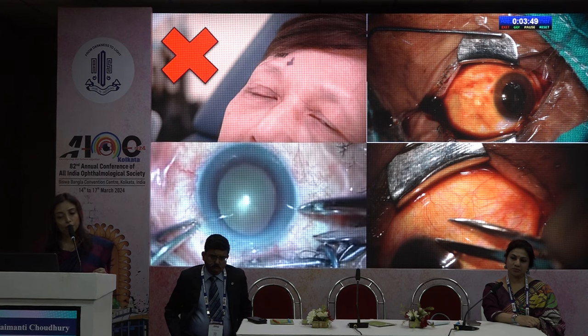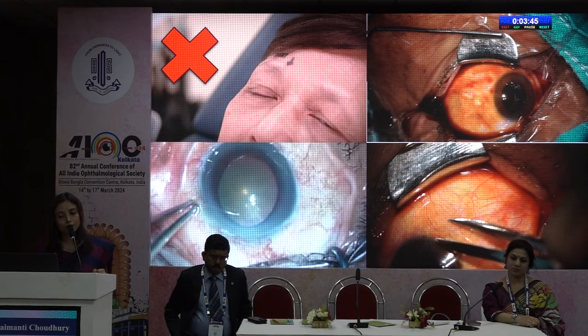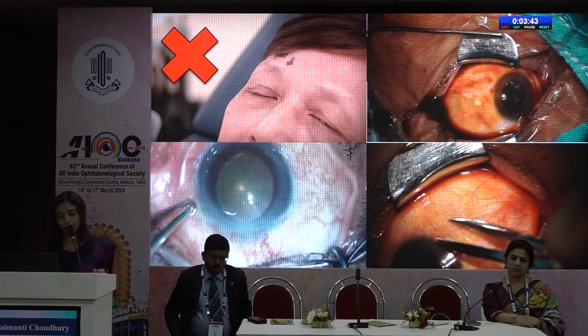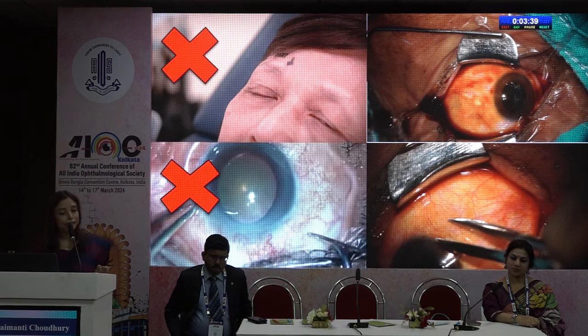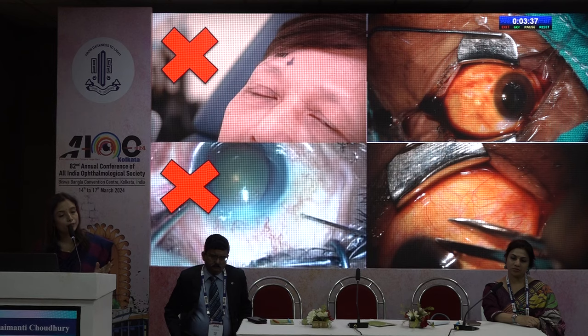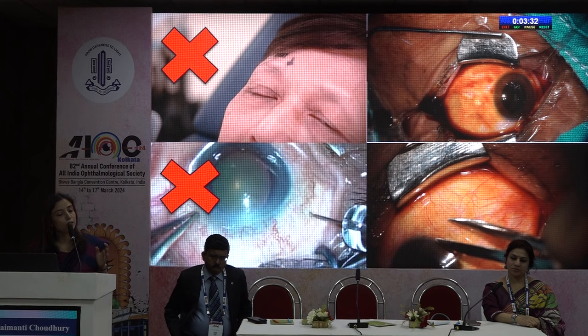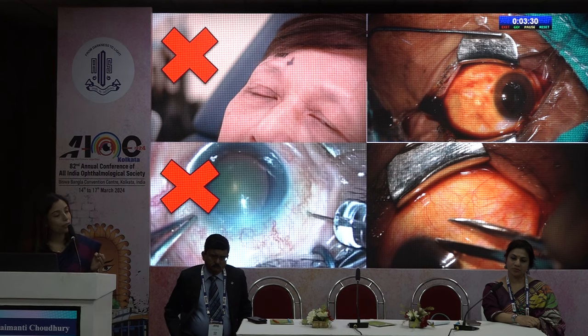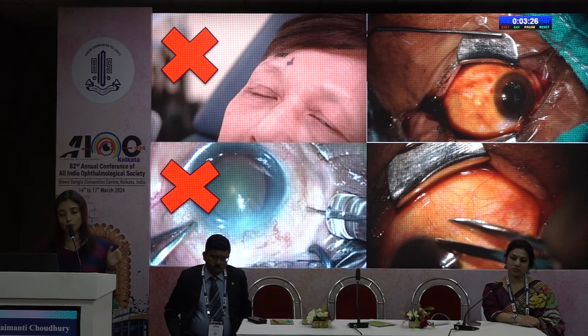Next, again, a mistake video. You will note here the surgeon has marked the area and then goes straight ahead and gives the injection. This is a mistake again because in the guidelines it is mentioned very, very clearly that the last substance that touches the conjunctival cul-de-sac prior to your injection should be 5% povidone iodine. There are no two ways about it.